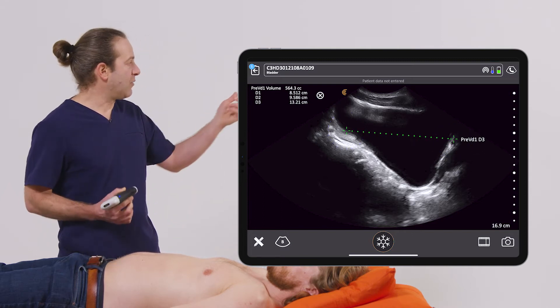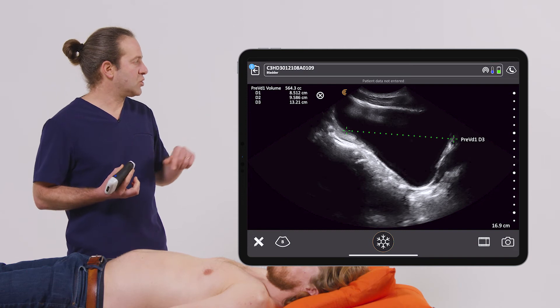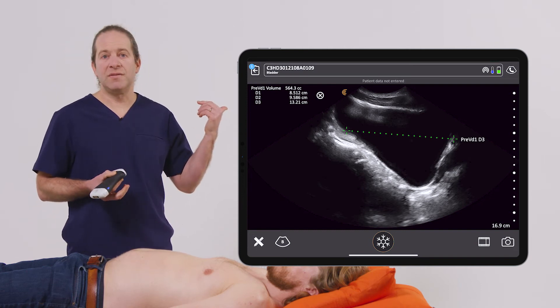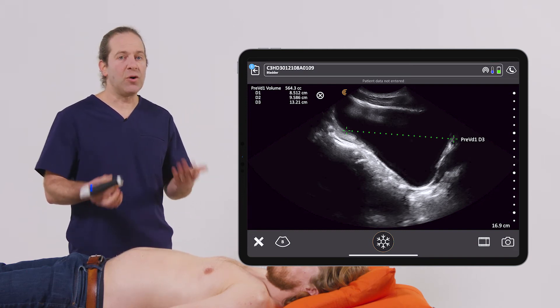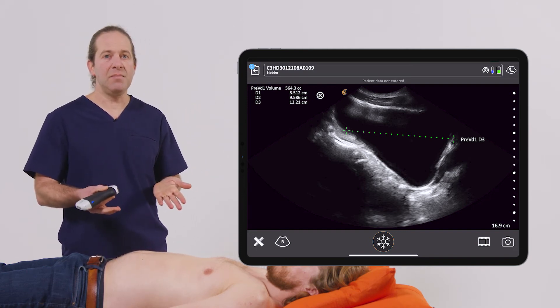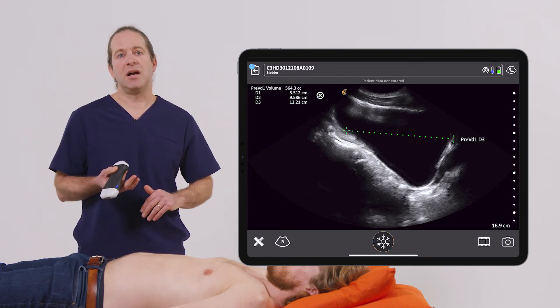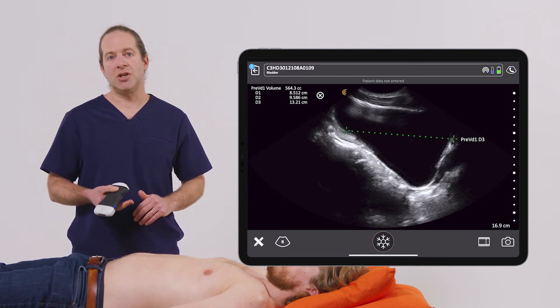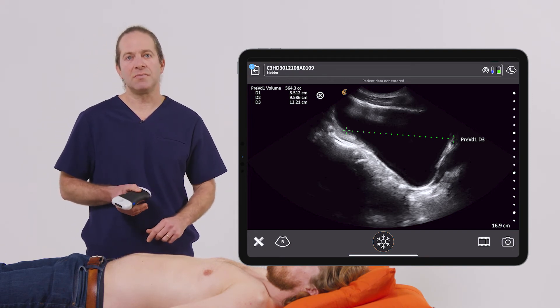The app itself will calculate for me the pre-void residual of 564 cc's in this case. I can perform the same scan again post-void, to compare the two and see if there really are signs of urinary retention to help facilitate my diagnosis.